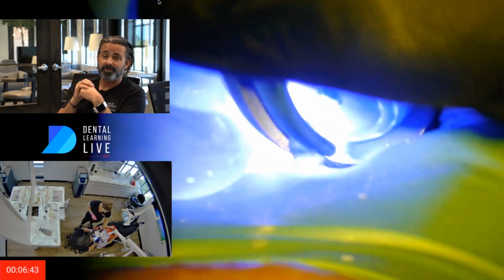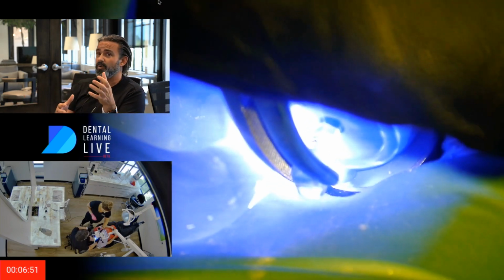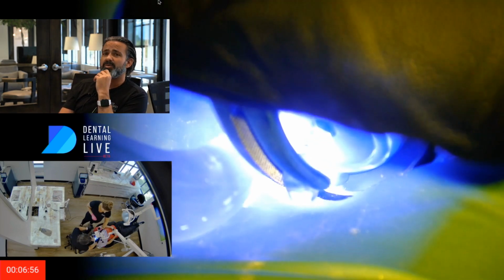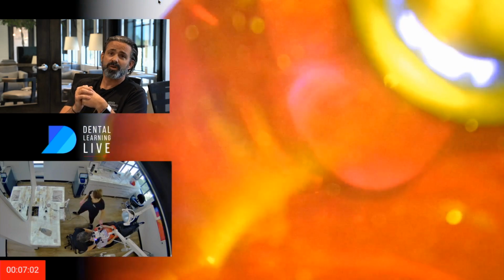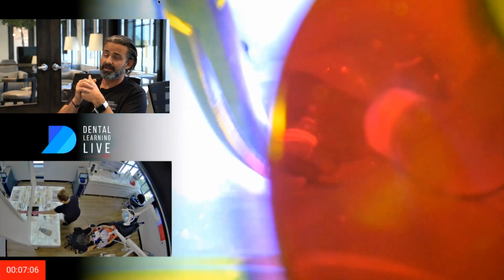I want platform security. Make that as secure as possible because of his movements. I know I have to maintain a seal, but I don't want to dislodge it if he's going to pull away from me. And the trade-off is, what would happen if I was trying to thread the needle with a file and he pulls away? That's where I'm going to get into trouble with file separation with those kinds of extreme movements.